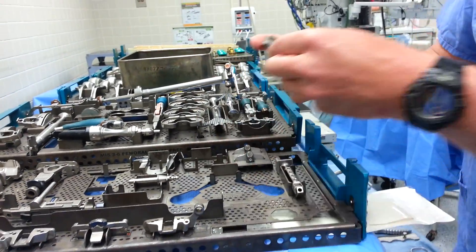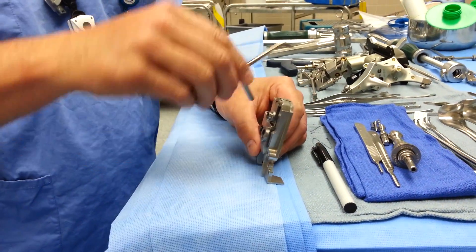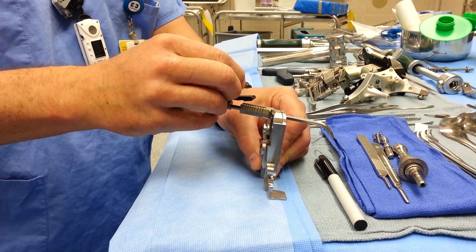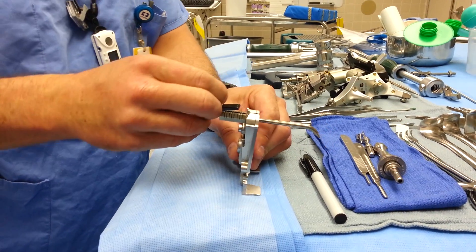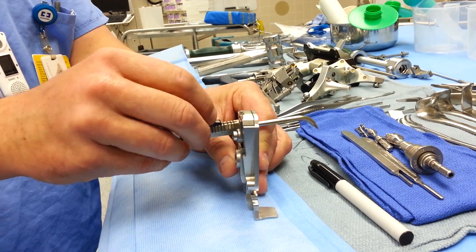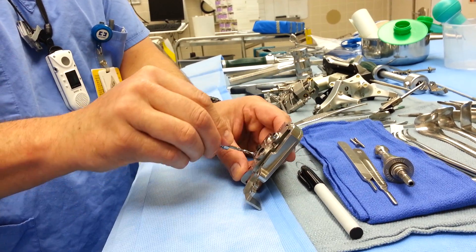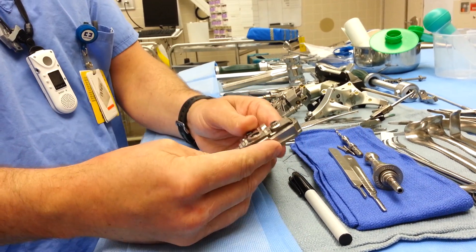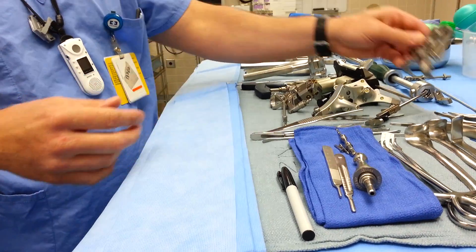The only other thing you need from this tray is your sizing guide. This will sit on top of — when they put this on the distal femur — they will set this in here, dial it in, place it on top of the femur, and decide where they want to make their cut so they don't notch. It would stop and indicate, for example, a size four. If the doctor says it looks like a four, they'll take it off, drill two peg holes with the peg hole drill. This is usually pinned on with top hat pins or pins from a pin driver. Once the holes are drilled, they'll pull this off and ask for a cutting block.